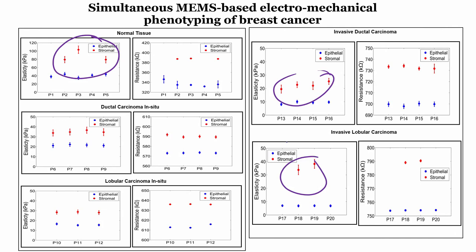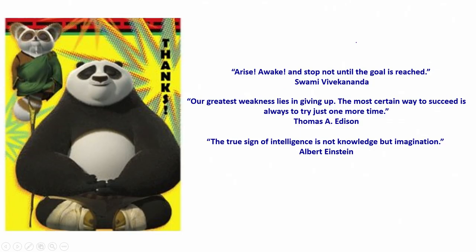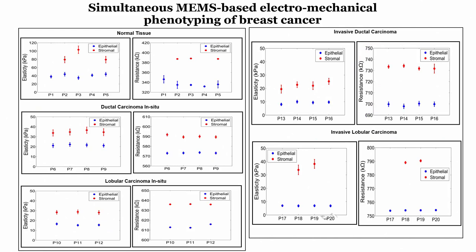So, what we really see is that as the cancer progresses, the tissue gets stiffer, right, and that is why the elasticity value goes lower; it is less elastic, it is more stiff, while the resistance of the tissue increases. Thus, this sensor can help us to understand not only the elasticity, but also the resistance property. Thus, we can not only understand the mechanical property of the tissue, but also the electrical property. Right. Now, let us see.